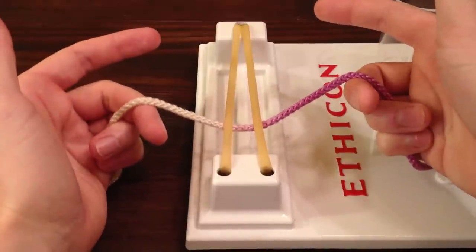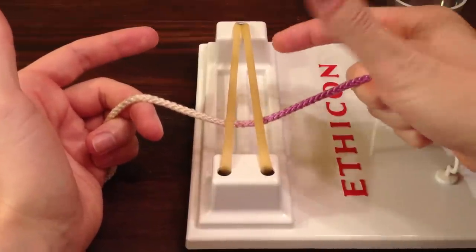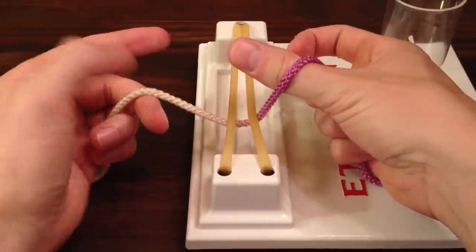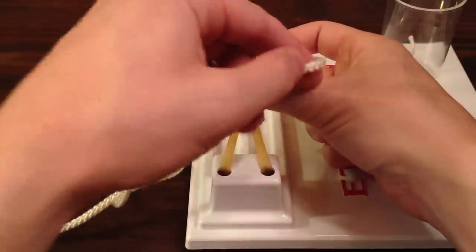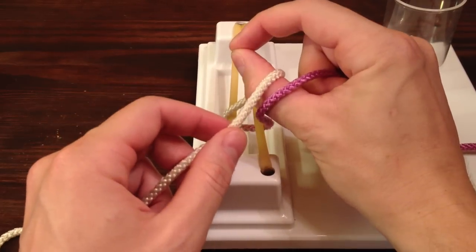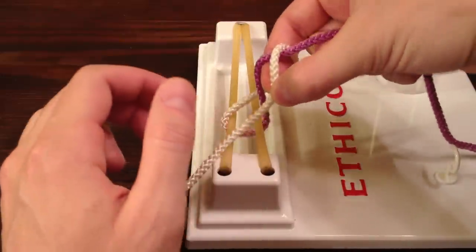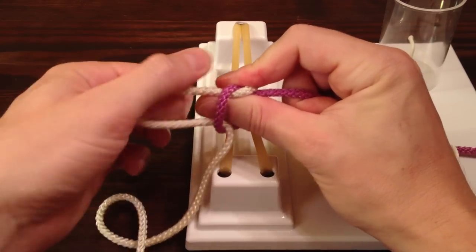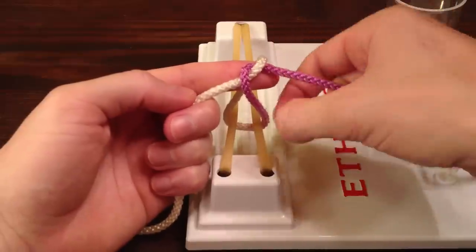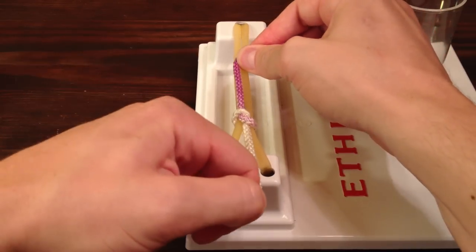And now to tie all these knots, essentially it involves forming a ring with your right hand and just rotating it several times with each throw. So to start, we're going to rotate it first away from us, and you can see that the purple string is now draped over our thumb. We're going to take the white string and drape it over our thumb in the opposite direction. You can see that this forms a nice little loop. When you reform the ring, you can rotate it towards you, grab the free end, rotate it a third time away from you, and pull the free end through the loop you just created — and you can see that we get an overhand knot. So by rotating this ring three times, you tie an overhand knot. After you tie the knot, you pull it tight, and that's our first knot.